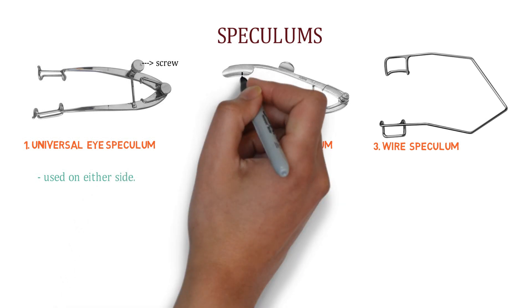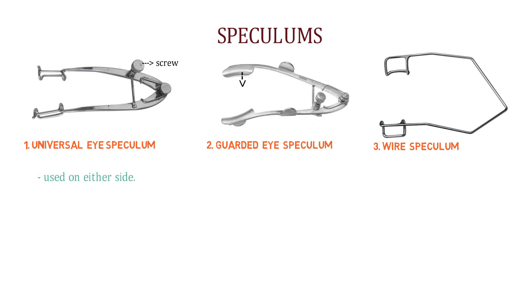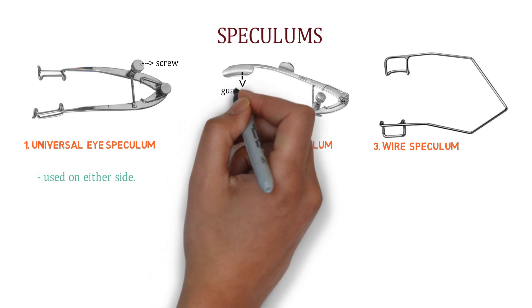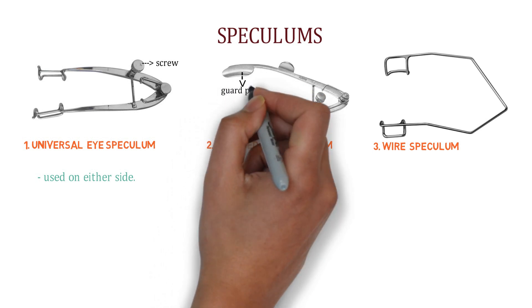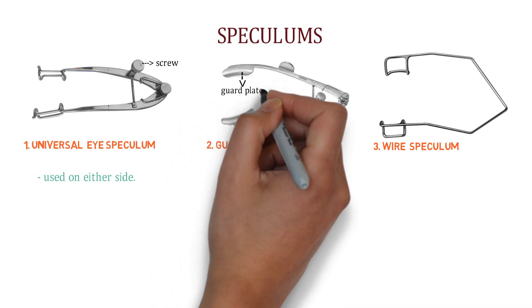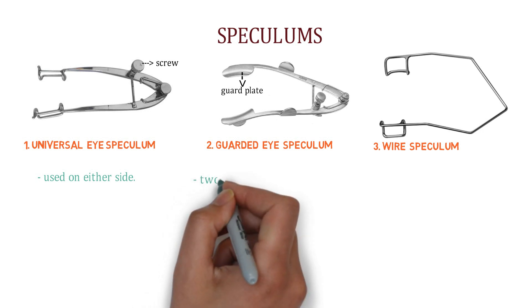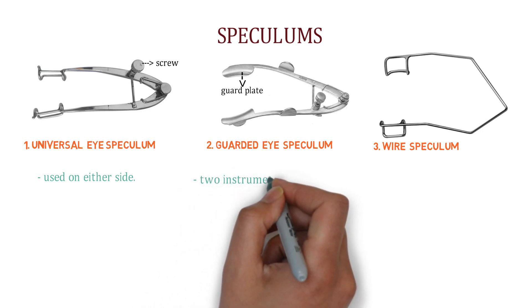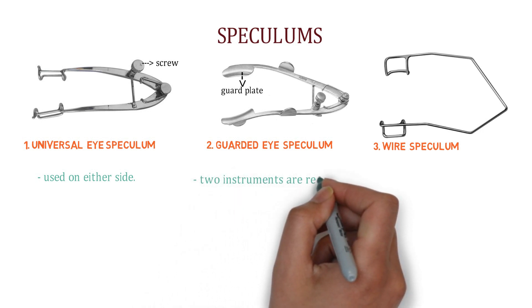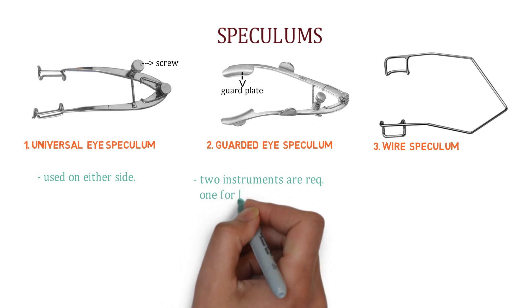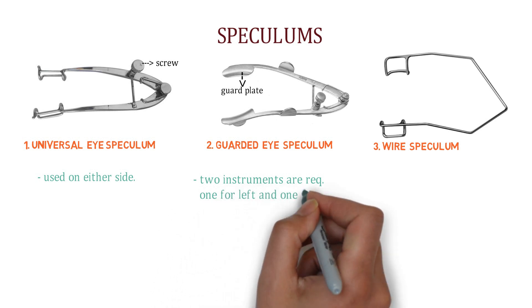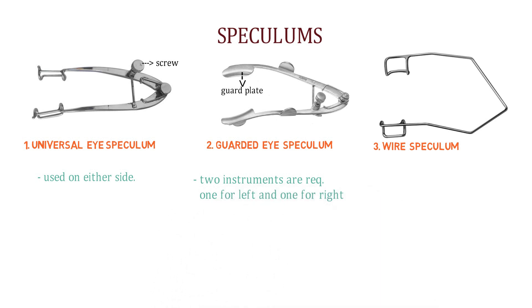This is guarded eye speculum. So how can we identify it? The upper limb of the speculum is having a guard plate, look over here, which keeps the eyelashes of the upper lid away from the field of operation. So two instruments are required, one for the right eye and another for the left eye.